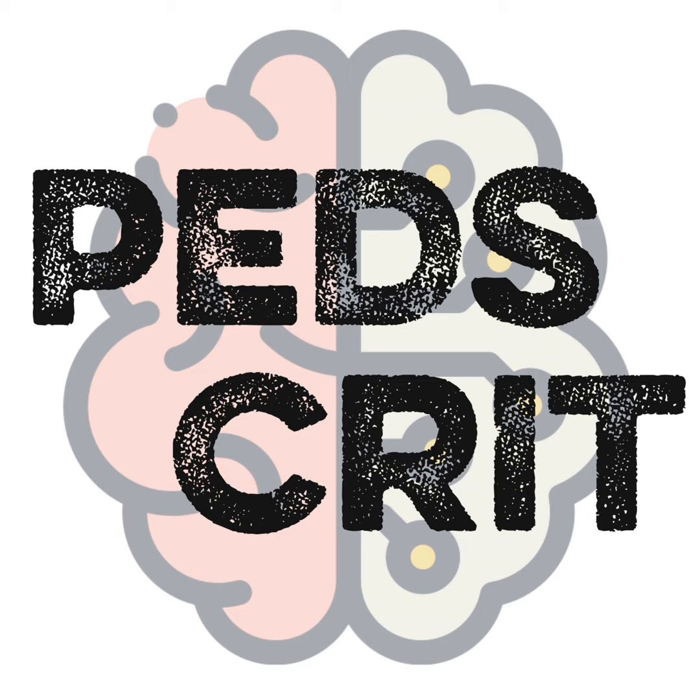Right. Nice. Okay, so this is the best case scenario, is that you've done a clamping trial. The data is beautifully presented to you from T3. You decide to move forward. If a patient isn't showing cardiac recovery, but they've got adequate other organ function, like adequate lung function, when do you start to think about transitioning them to a VAD? How do you make that decision?